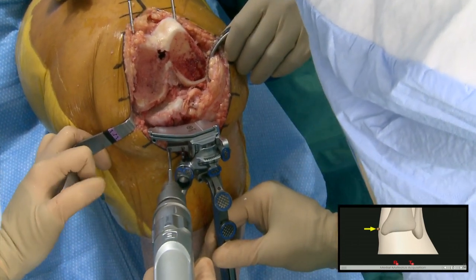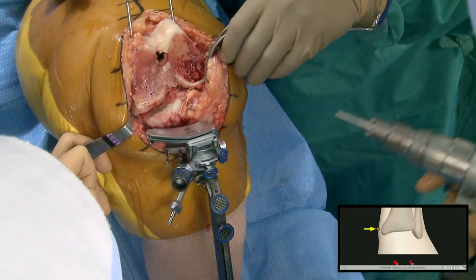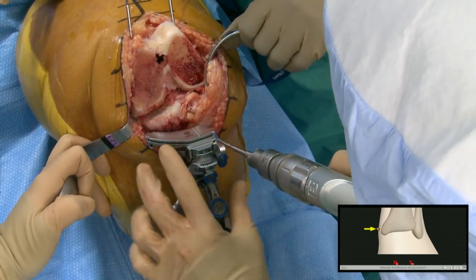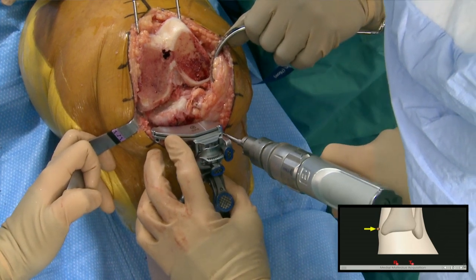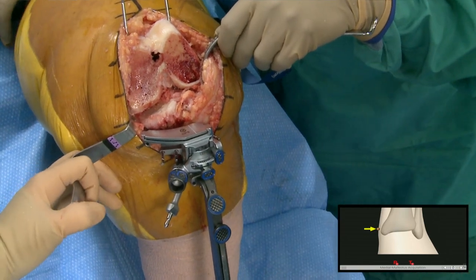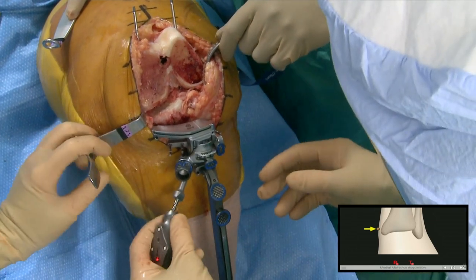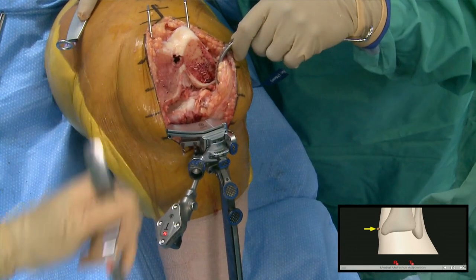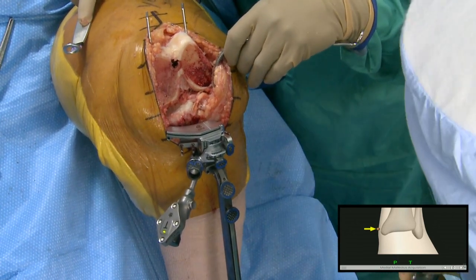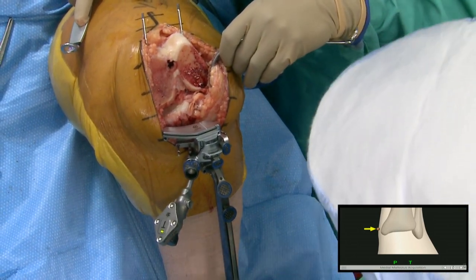We put a couple of smooth pins in as a ballpark, then fine-tune with the adjustment. With the EM guide you take a little more time stressing about alignment, because gap balance — you've got to get that right. But with this system you say, well, if we get in the ballpark we at least have the adjustability. Now we're going to register. This is rigidly fixed and it becomes our tracker.